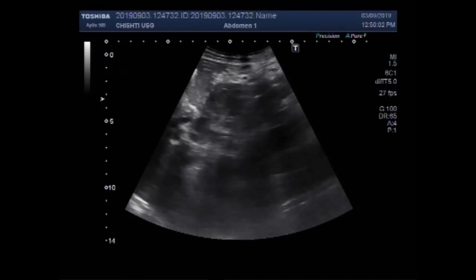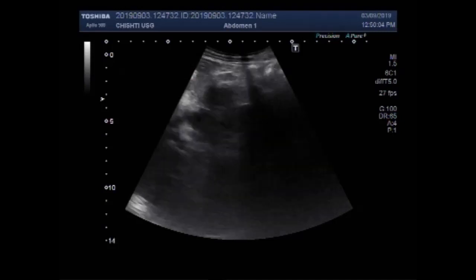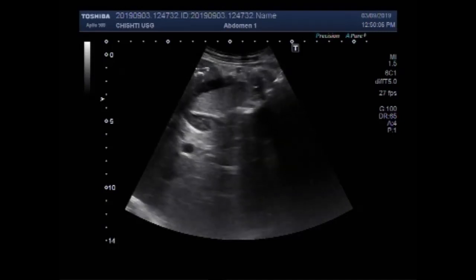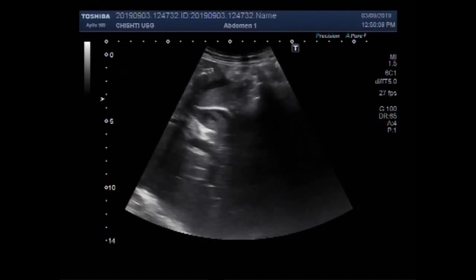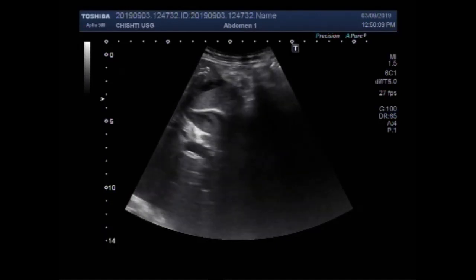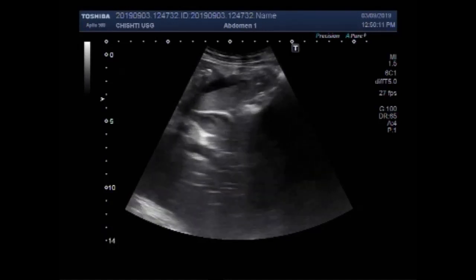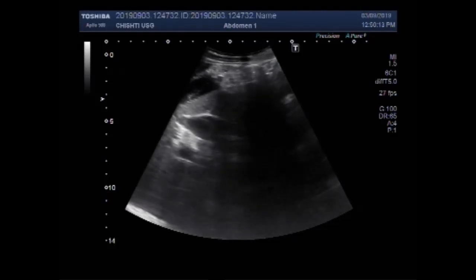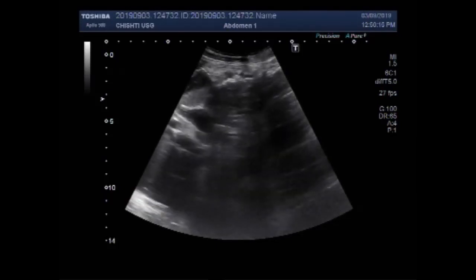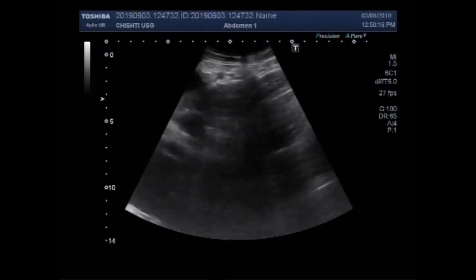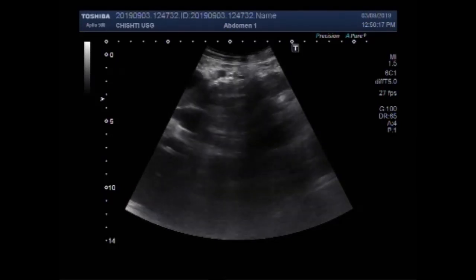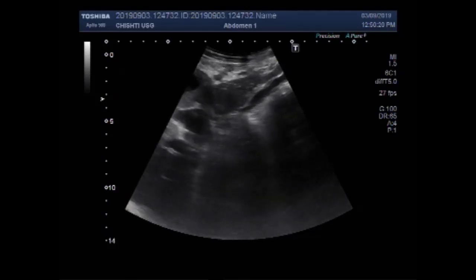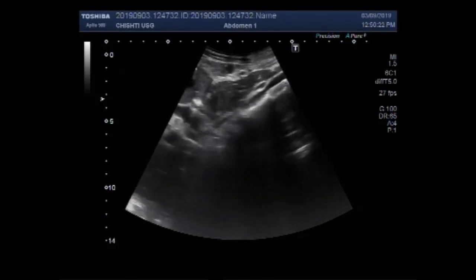Gallbladder sludge, also known as biliary sludge, is biliary sediment or thick bile. It is a mixture of particulate matter and bile, normally seen as a liquid-liquid level in the gallbladder on ultrasound, corresponding to the precipitate of bile solutes.